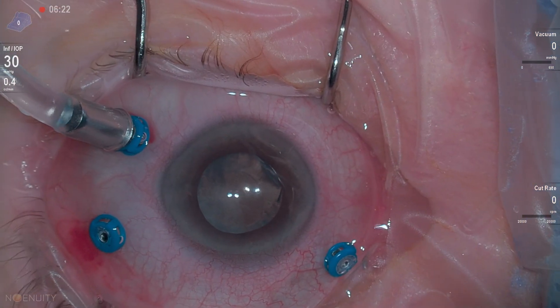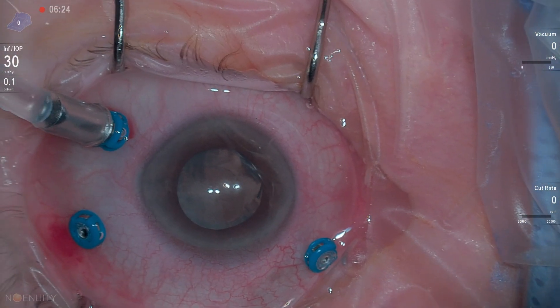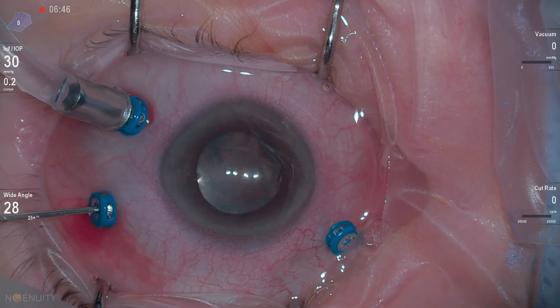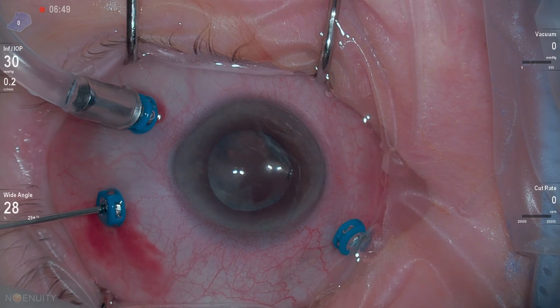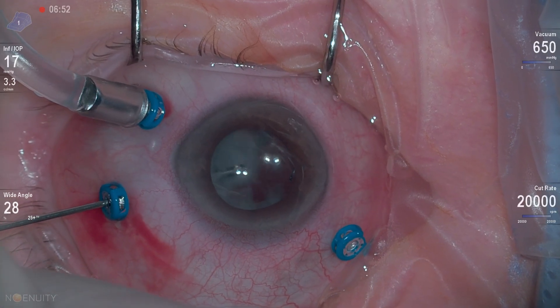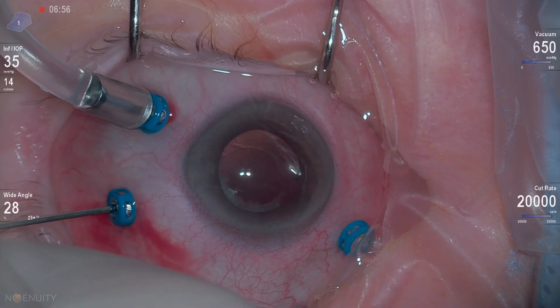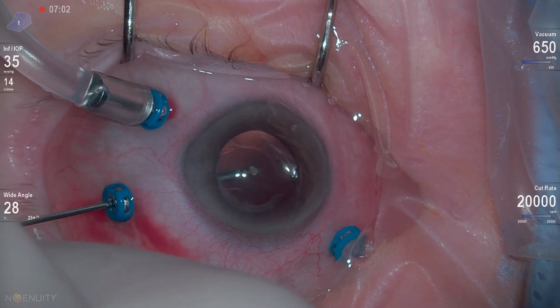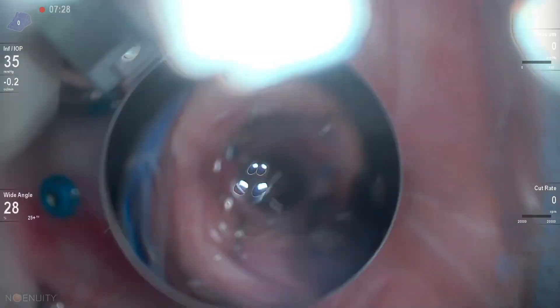This is the basics of a pars planar lensectomy case. Some of these portions have been sped up just for time's sake. When we start out, we want to get a good view. We put our cutter in, with direct visualization and infusion on, and we try to clear out the visual axis. Here you can see we free up a lot of residual lens material right behind the IOL.